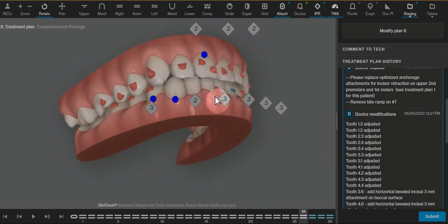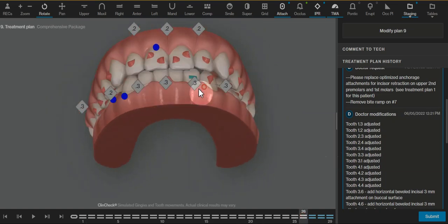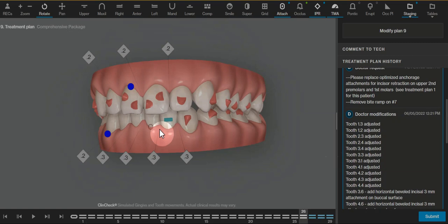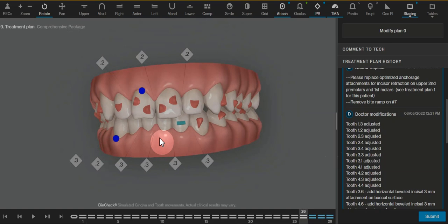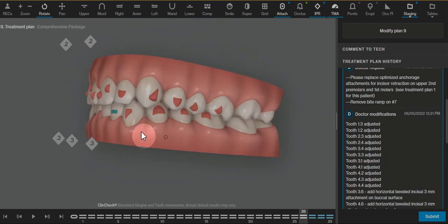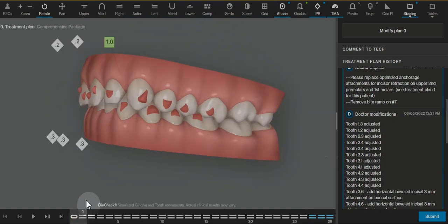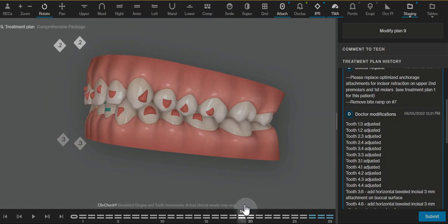If you wanted to create more inter-arch space, you would simply need to increase the lower IPR and possibly add more intrusion to the upper centrals. But otherwise, another option would be to redistribute some of the upper space distal to the upper canines.